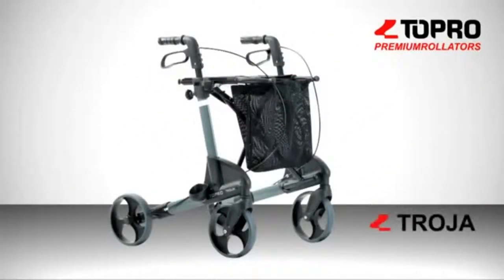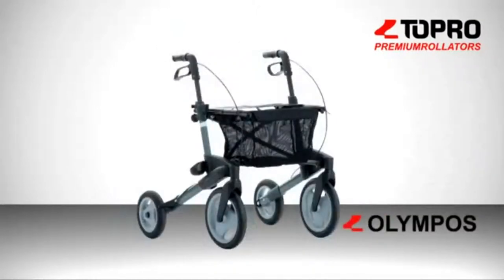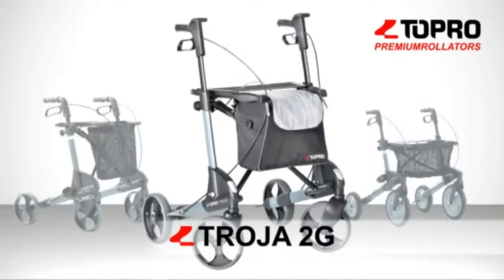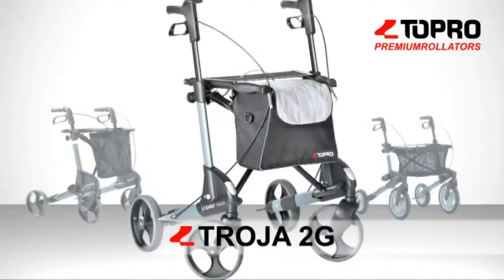Topro's rollator family has just grown bigger. Besides the original Topro Troja and the outdoor type Topro Olympus, the Norwegian company is now rolling out the Troja 2G second generation. This premium rollator sets new standards in terms of comfort and safety.